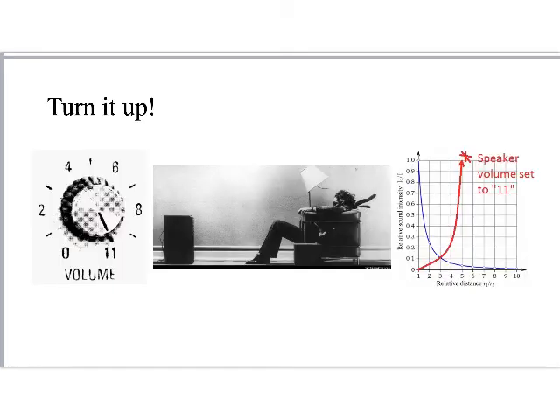But here's another way to think about it. Go back to the movie Spinal Tap. If we're increasing that distance, if our parents said go to your room, we're going to go to our room and turn the volume up to 11, right? Because turning the volume up to 11, we just compensated for that increased distance. We're going to do the exact same thing with our X-ray machine. If we have to shoot it a further distance due to the way the patient's room is set up, or the technique calls for it, we need to make this change. We're going to need to turn up the mAs on the X-ray machine in order to compensate for that distance change.